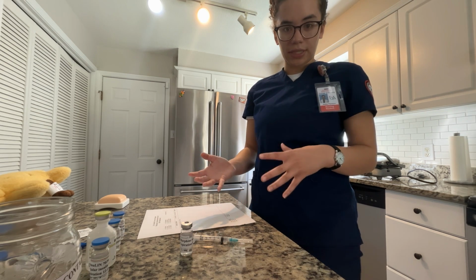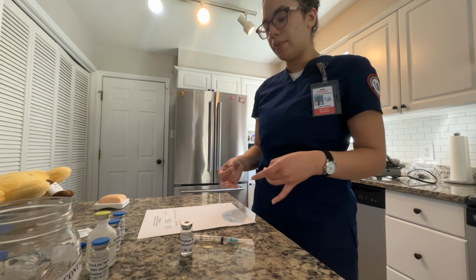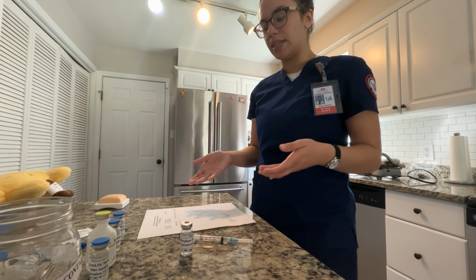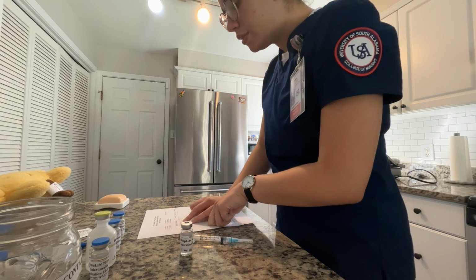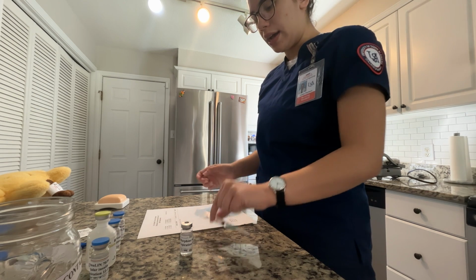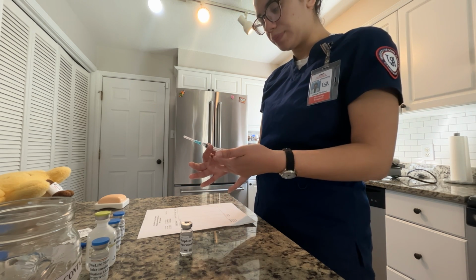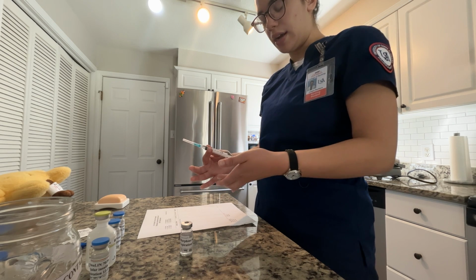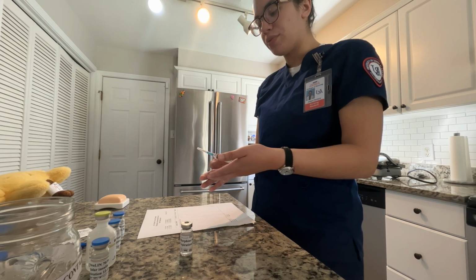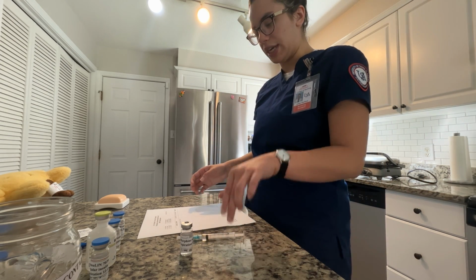Again, I would redo this calculation to ensure that I got the correct dosage, and then I would also get this calculation verified with another nurse, since morphine is a high-risk drug. So he is to receive this medication IM. So for an IM injection, a 3 milliliter Luer-Lok syringe is a good syringe for this injection, and a 23 by 1 inch needle is a good needle for an intramuscular injection.